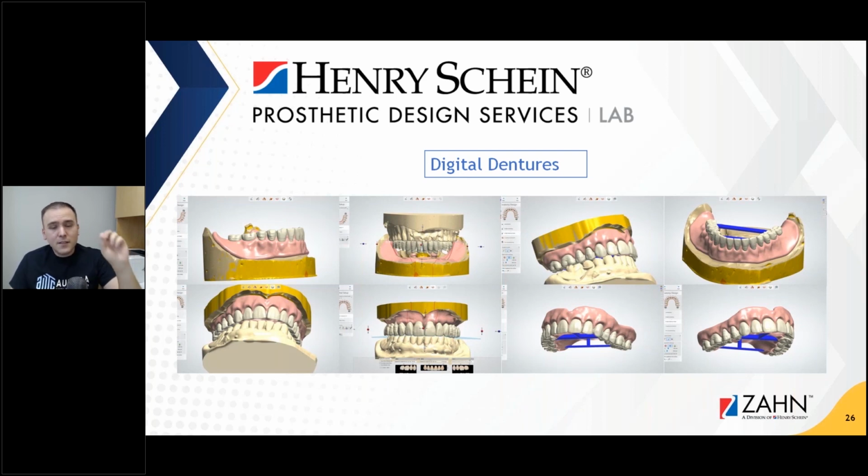And then having the ability to design upper and lower denture, just the upper or just the lower, might seem like a given. So what's the problem with that? Well, actually, in reality, a lot of these different softwares don't give you that functionality. There's certain software that only works if you're doing upper and lower at the same time, and that's it. Some other modules on the market only work if you can only do one arch at a time. You have to have the opposing dentition.